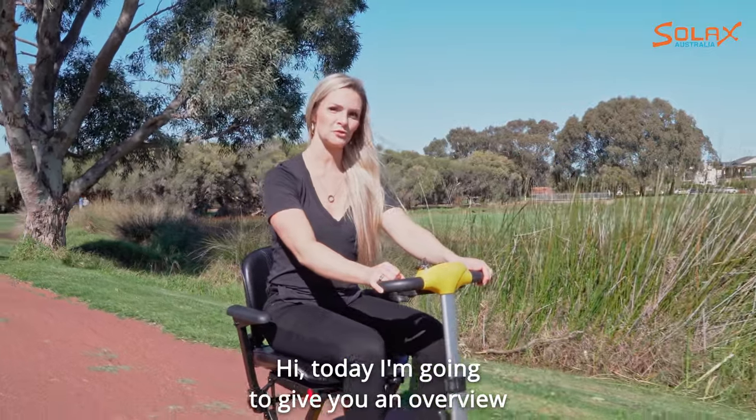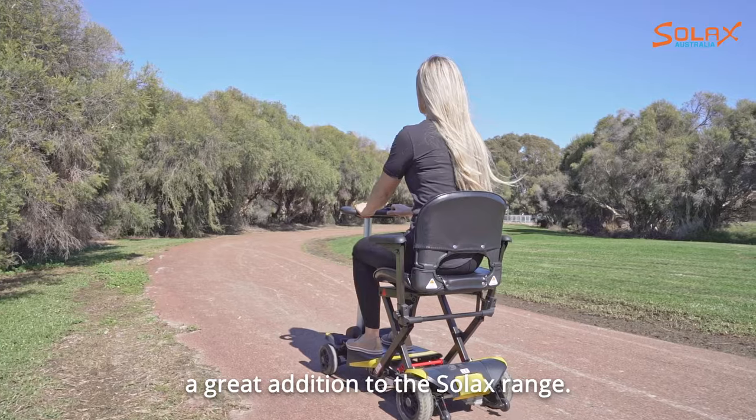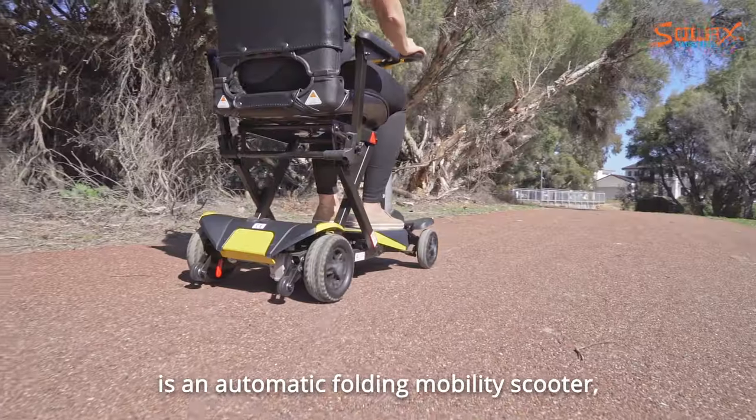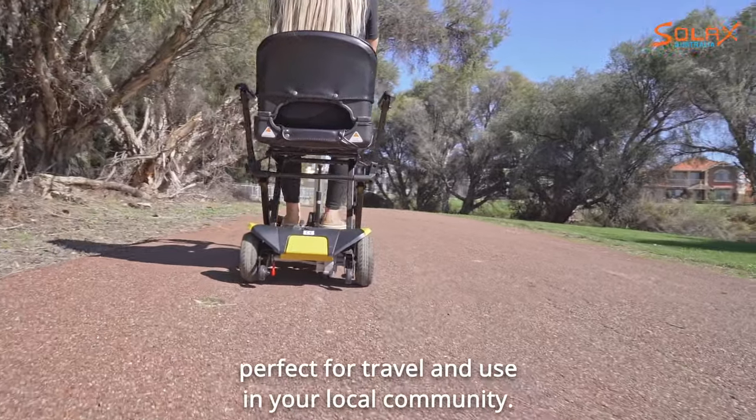Hi, today I'm going to give you an overview of the Solax Transformer, a great addition to the Solax range. The Solax Transformer is an automatic folding mobility scooter, perfect for travel and use in your local community.